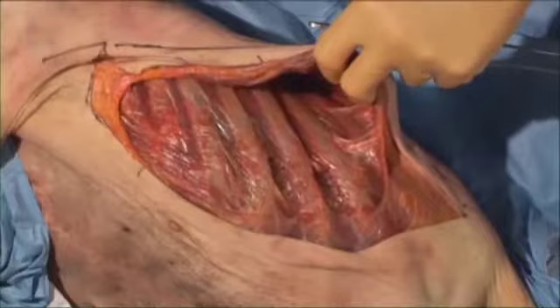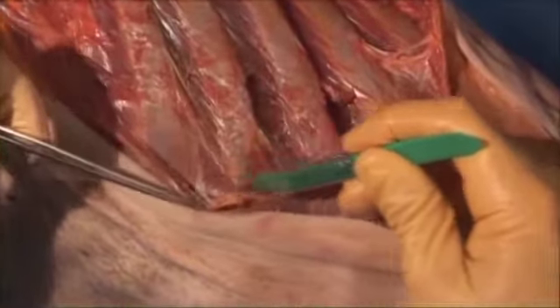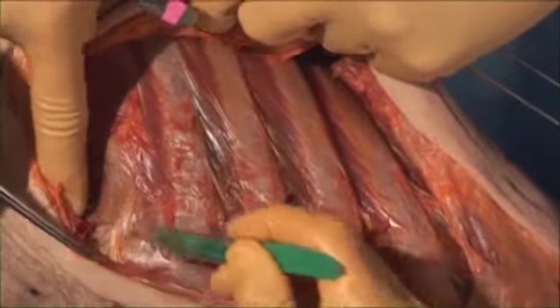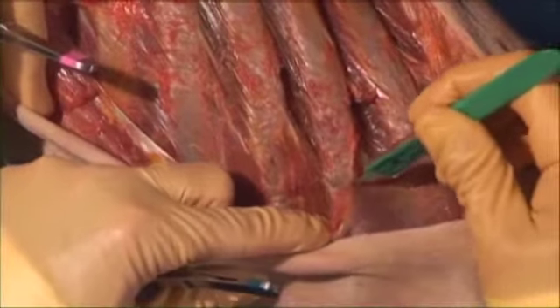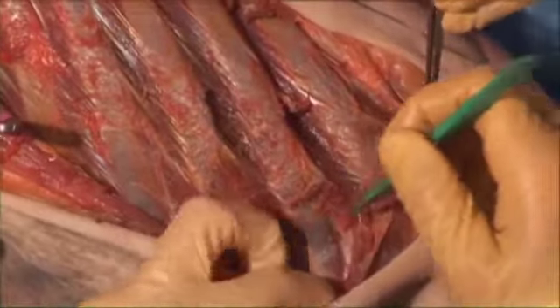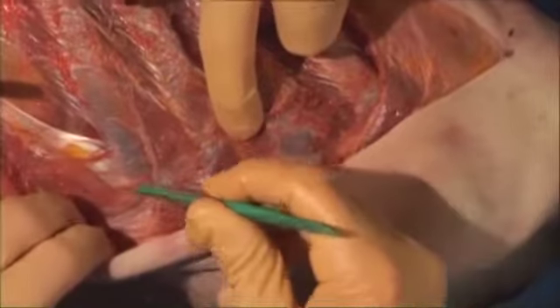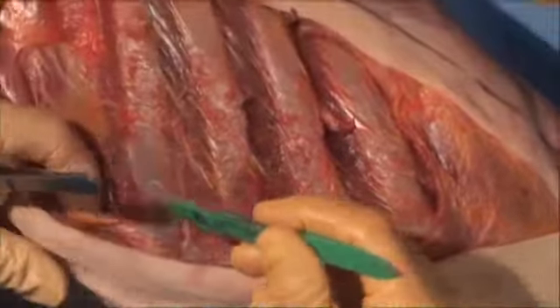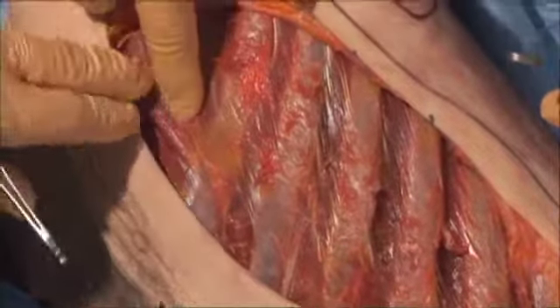Now you can also work, once you've developed that interval, you can also work down along the front. The obliques and the pec will be elevated anteriorly. Now we're at the costochondral junction here, anteriorly, and you can see we have complete access now to everything anterior and posterior without having damaged the serratus or latissimus. So a couple of slips of pec are left, but those can be elevated off as well.